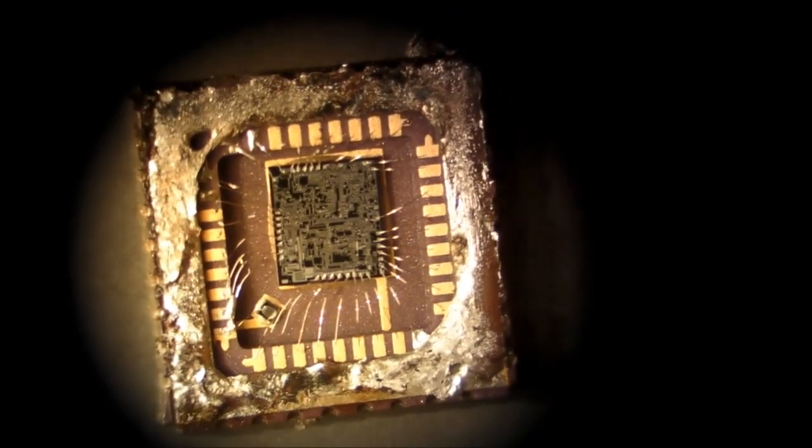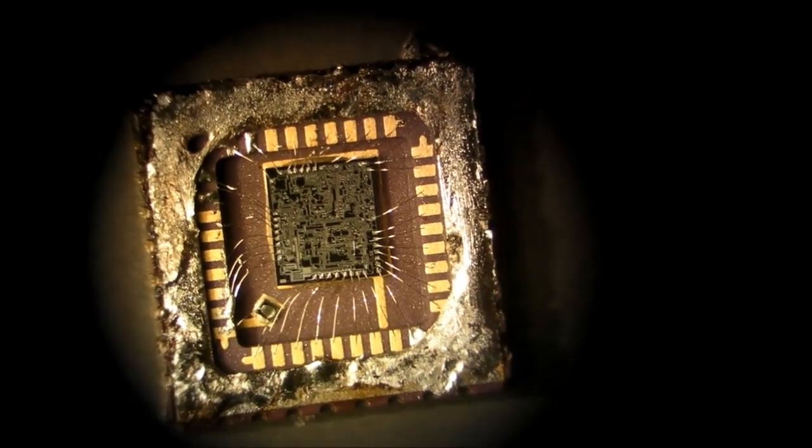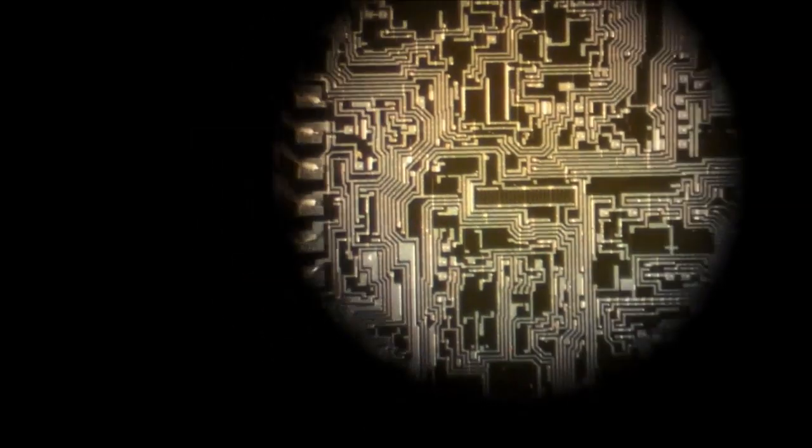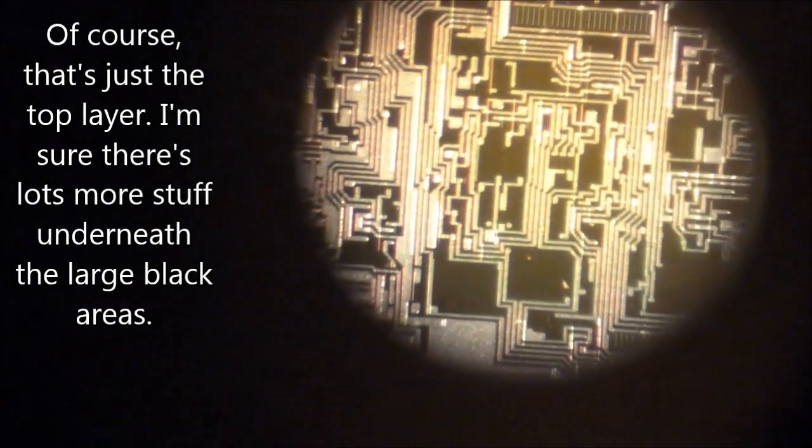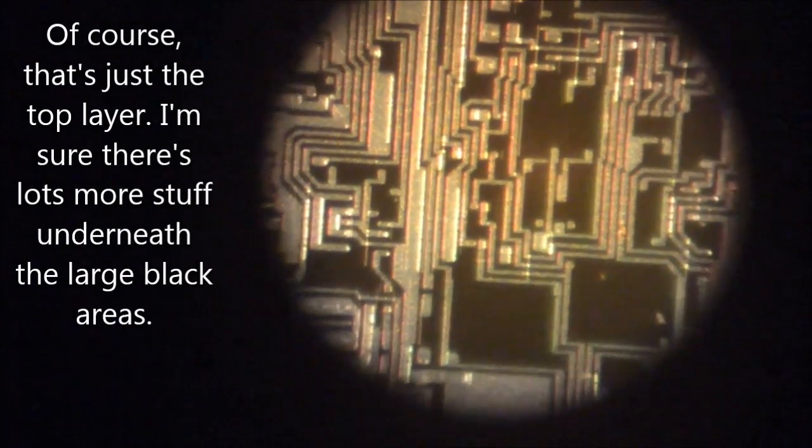All right, now here's the other one, the larger chip. Let me zoom in here. Looks like a lot more empty space on this one. It's not quite as crowded. Yeah, the features on this one are certainly larger.